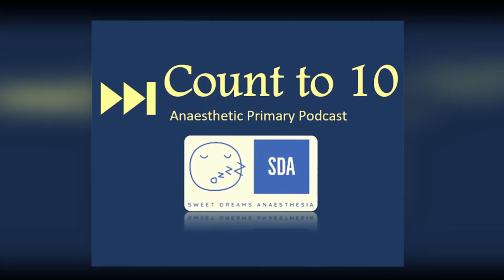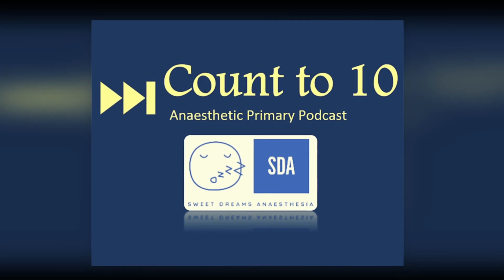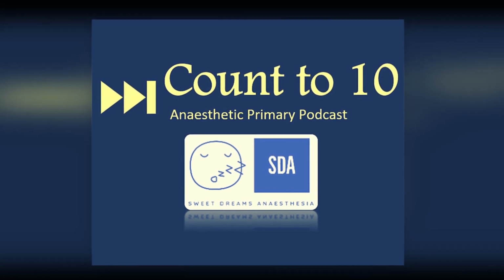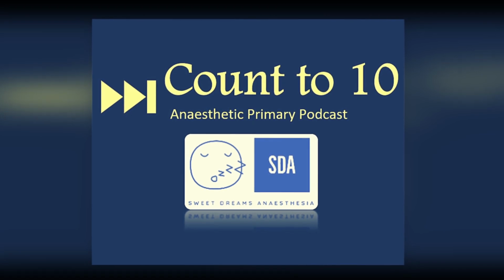that oxyhemoglobin and deoxyhemoglobin have different known absorption spectra of light, with oxyhemoglobin absorbing more infrared light, which is 940 nanometers, and deoxyhemoglobin absorbing more red light at 660 nanometers. Using these two principles, we can create an equation, which is the R equation for the ratio of absorbance, and then that gives us a number that we then relate back to our SpO2.